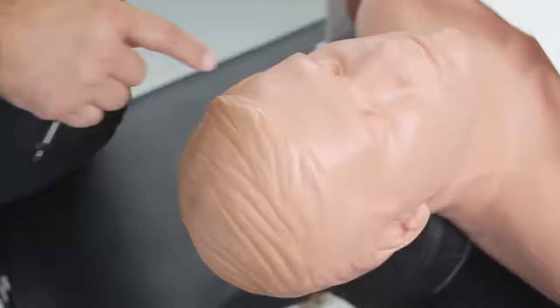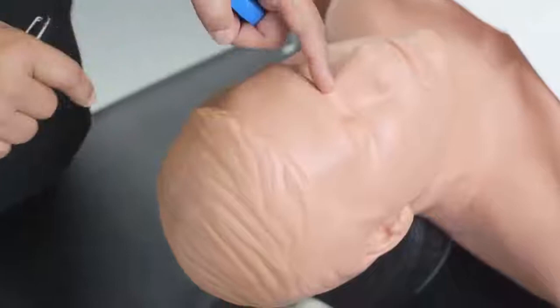What we like to do is go to the pre-operative area, talk to the patient, and measure the head and mark the points we are going to use for placing the electrode. In order to do that, make sure you have two important things in your pocket: one is a flexible measuring tape and a marker. You can use any color of marker of your choice.